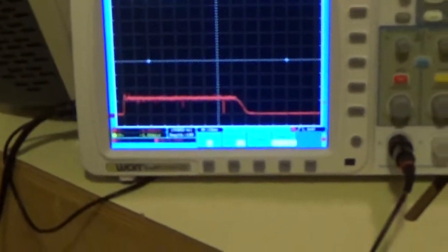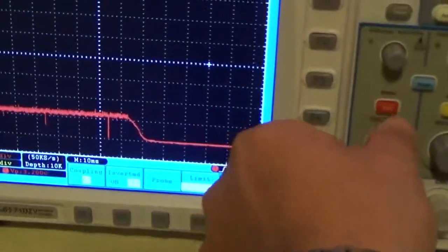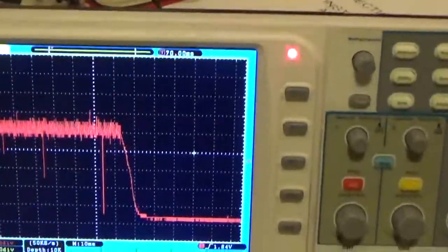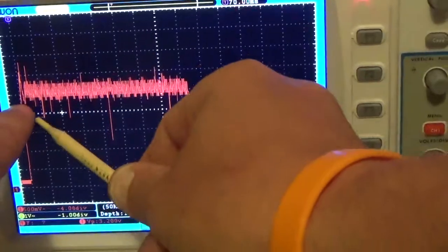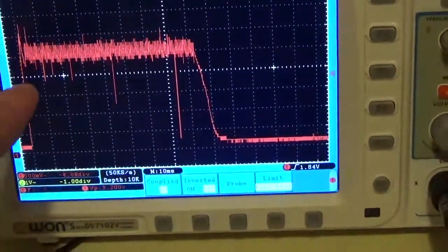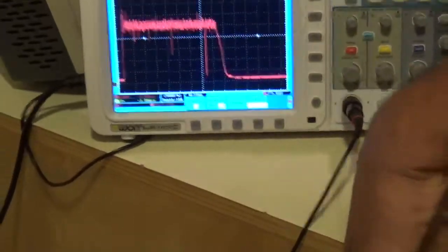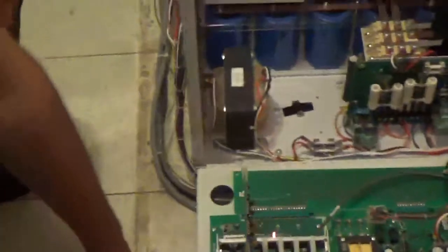I would have changed my scaling a little bit. But if you look, that's pretty good. It's got a wee little bit. See how it's trying to compensate too fast, so it undershoots a little bit? So it's overshoot, then undershoot, then levels out. You like that? We should probably take about a quarter of a turn off of that one. That same one, or is that 62? 62. Okay. So quarter of a turn, counterclockwise. You say 62. 62.